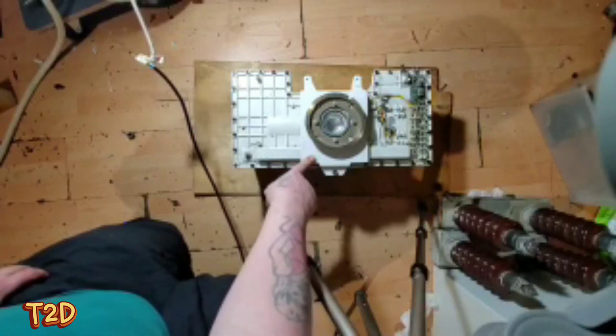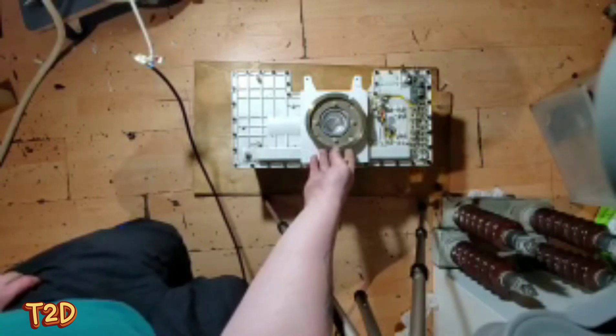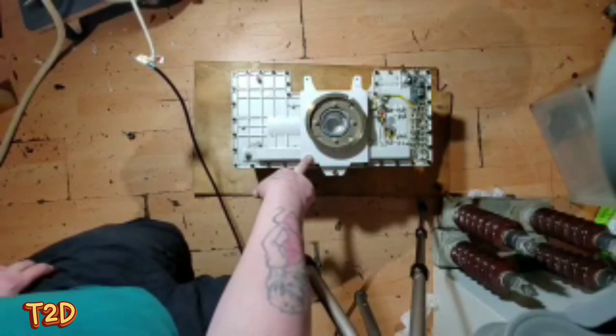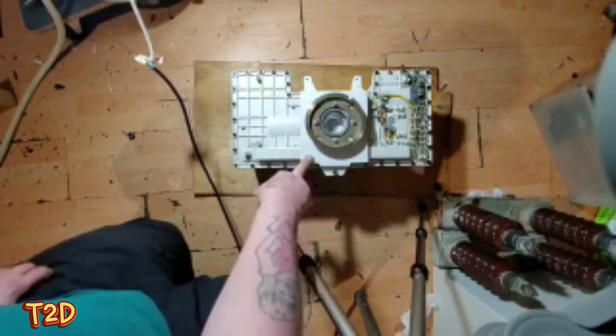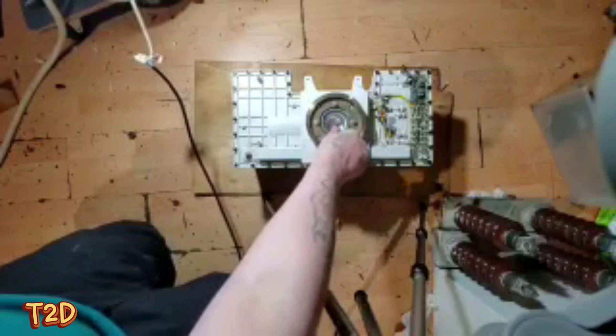We're going to take this apart and we might go a little bit further than Kaiser did. We'll try and get this tube running - not putting out x-rays, but we'll try and get it rotating and have a little play around with the power supply inside. So we'll crack this open.